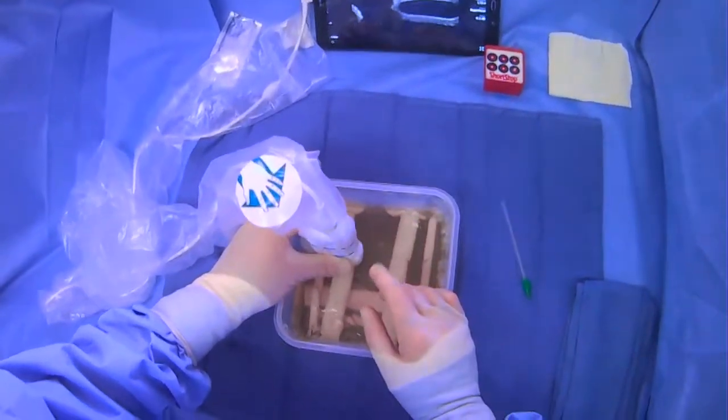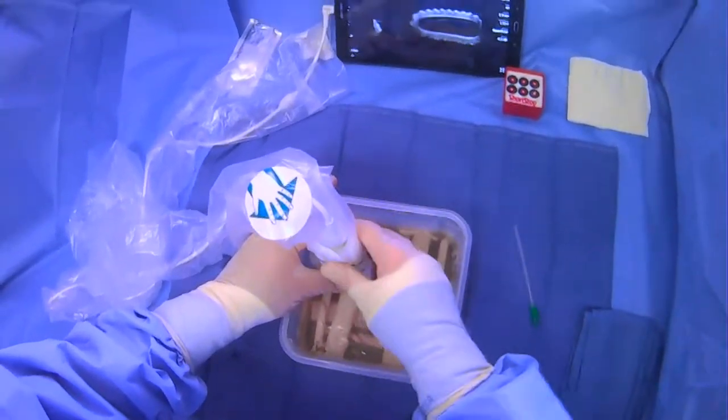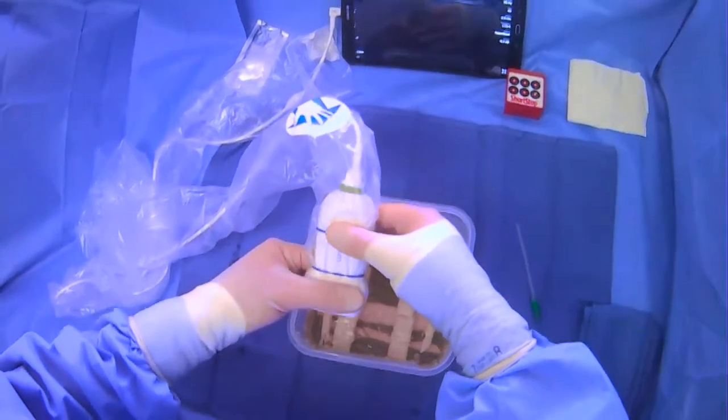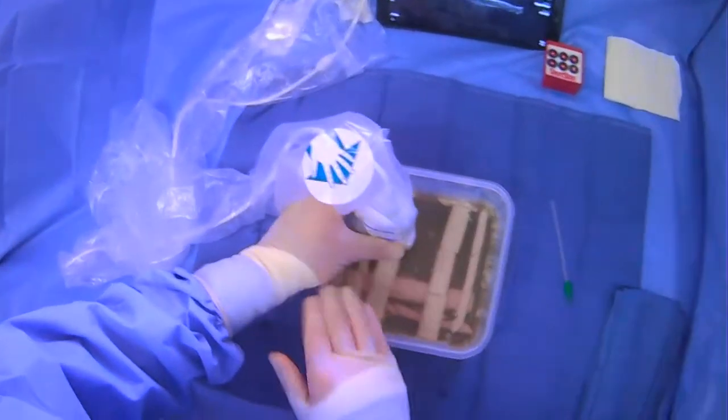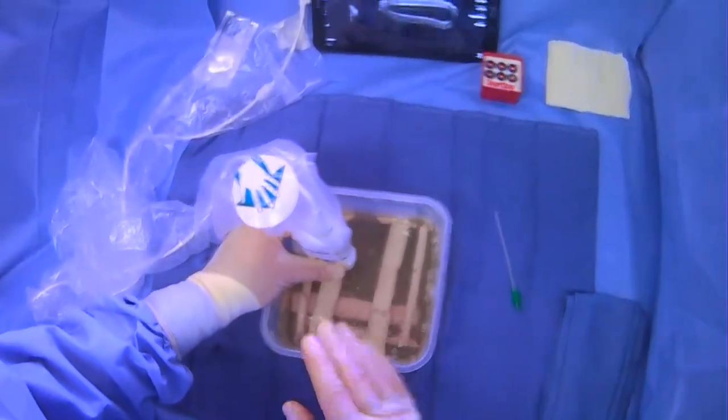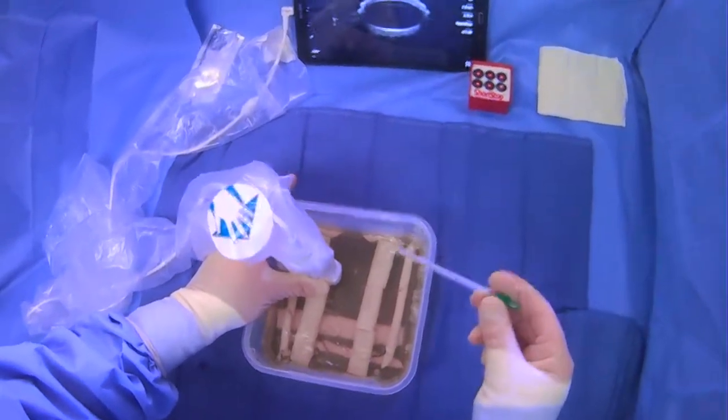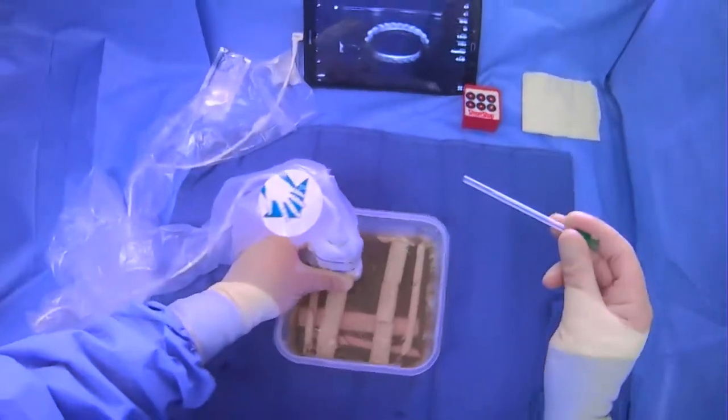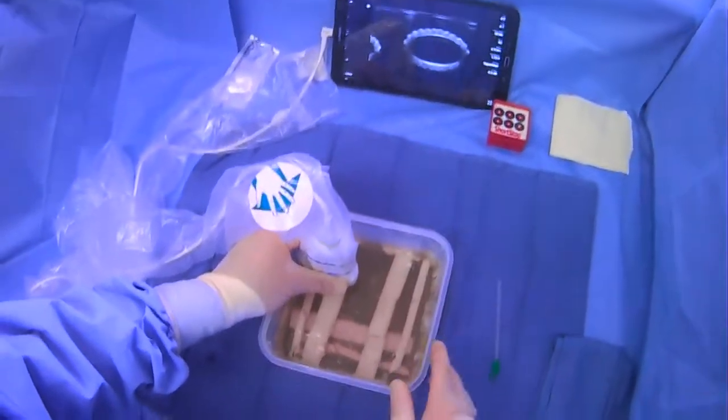Let's say that you're going to gain access from this direction. The way we held the probe, this is great. So you can hold it like this. You can put it down here. Very stable. You're resting your hand on something secure. And what's great about this is when you grab your micropuncture needle, you can just come from the side and you can see the probe very clearly. There are no issues. Your fingers are not in the way. So this is very straightforward. This is great for gaining access in that direction.